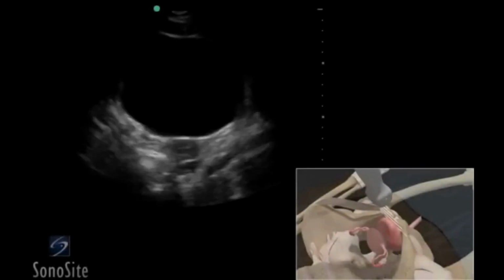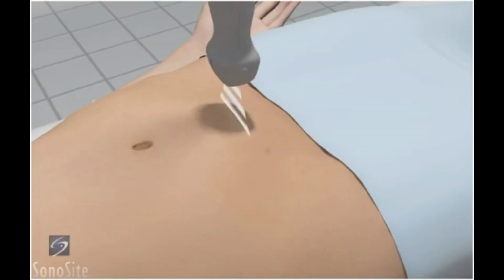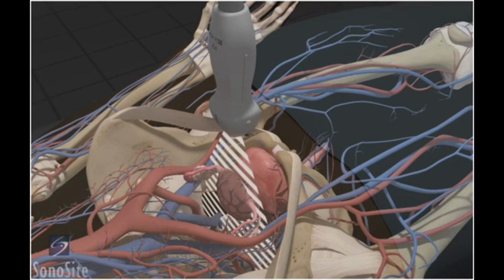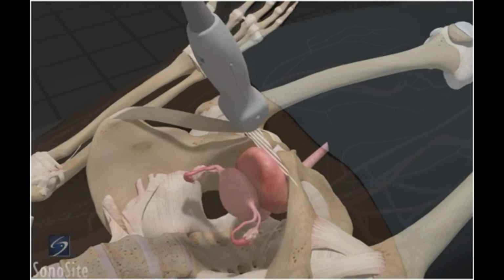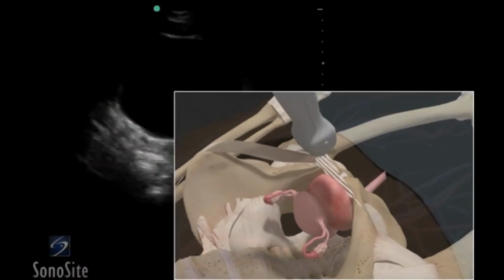A phased array transducer with an abdomen exam type is used to perform the pelvis view of the FAST exam. Place the transducer in a transverse position with the orientation marker to the right at the level of the symphysis pubis. The pelvis is evaluated in 2 planes. It is easier to perform this exam when the bladder is filled. The bladder is used as an acoustic window to view the cul-de-sac or retrovesicular space for free fluid. To visualize the bladder, angle the transducer inferiorly into the pelvis. If it is difficult to visualize the bladder, slide to the left or right of the symphysis pubis to bring the bladder into view.